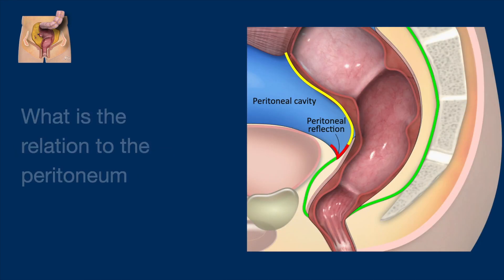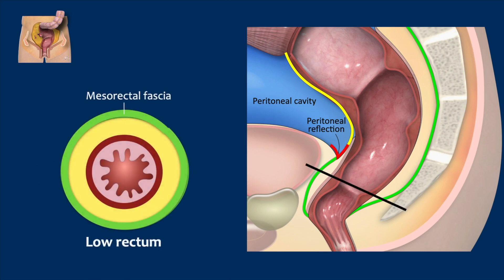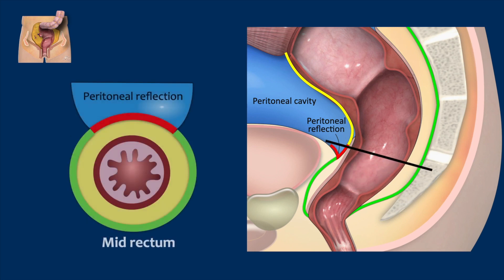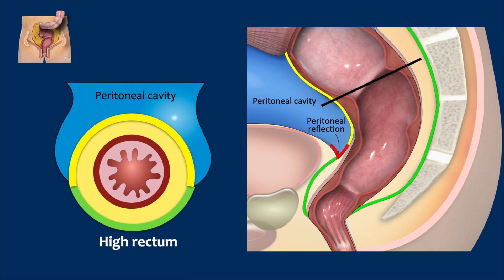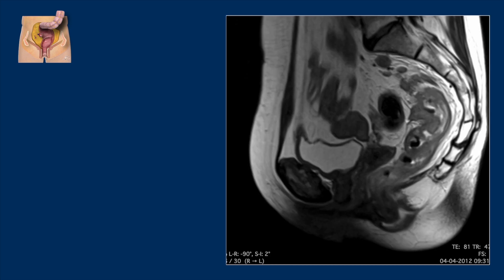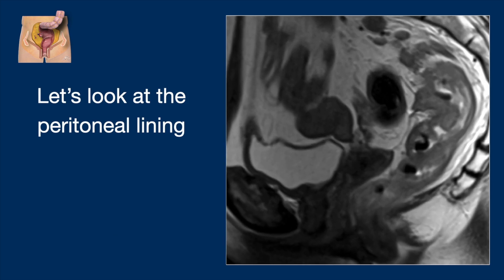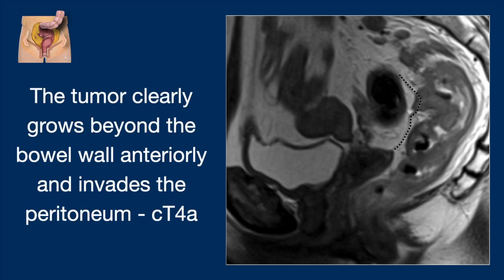Let's go back to the peritoneal reflection. A tumor at this level in the lower rectum may involve the mesorectal fascia or any organ, but it cannot invade the peritoneum. At the mid-level on the anterior or lateral side, it may involve the peritoneum. And at this level in the high rectum on the anterior or lateral side, it may also involve the peritoneum. In our case, the tumor clearly grows beyond the bowel wall anteriorly and invades the peritoneum — this is clinical stage T4a.